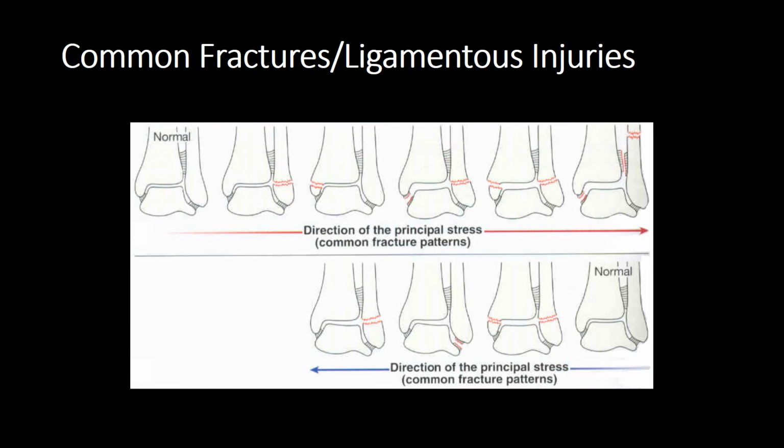So I want you to be aware of this, but at the same time, in your exam, don't use the clinical indications to then stop searching for other injuries. Patients are notorious for giving poor or even incorrect clinical history. So whilst I would like you to have an understanding of these common fracture patterns, don't use the clinical history to cloud your judgment over what fractures you'll be seeing.